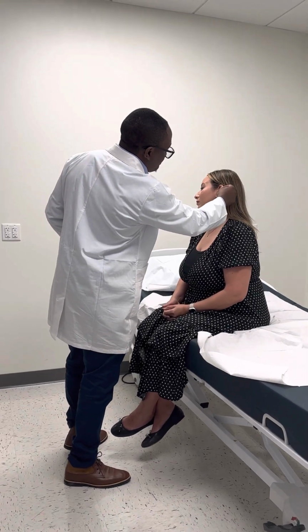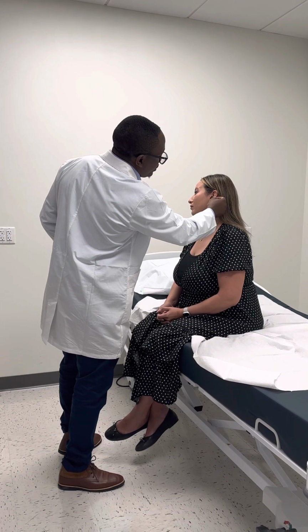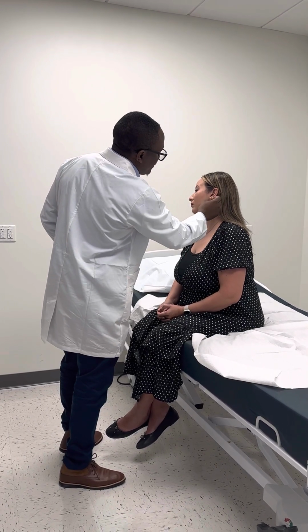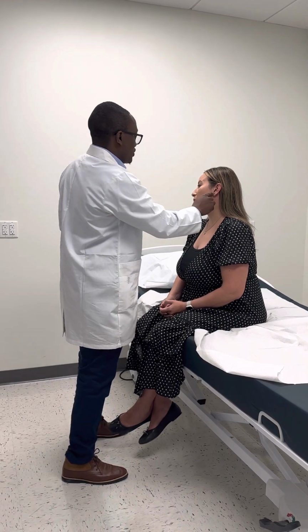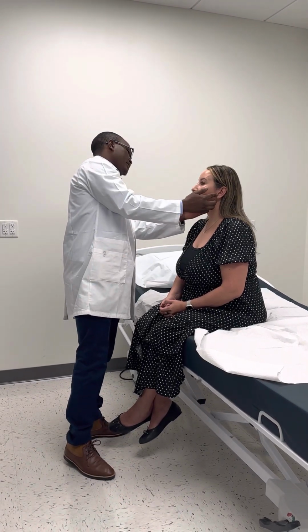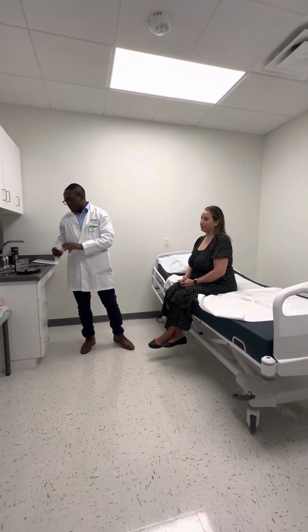Same case here, the pinna. It's so symmetrical. No discharge noted. On the tragus, do you feel any pain? No. On palpation of the tragus, any pain on it? On this side? So no pain. So I'm going ahead to use my otoscope.